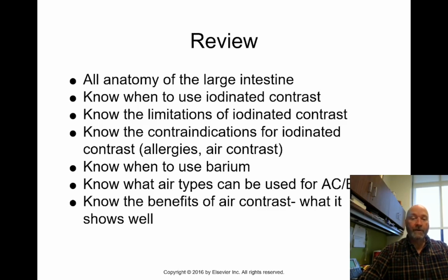Know when to use barium and when not to use barium. Most of the time, if possible, you want to use barium, certainly for double contrast. But again, if a patient has suspected perforation, you don't want to use barium. So make sure you take a history. If the patient's passing a lot of blood, and if the patient knows that they've got a perforation, then that needs to be communicated to the radiologist.